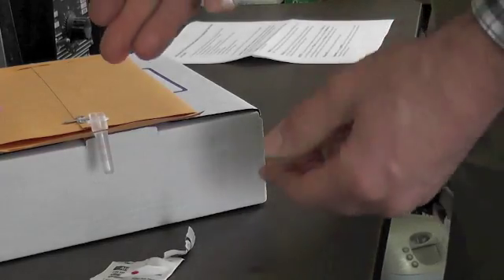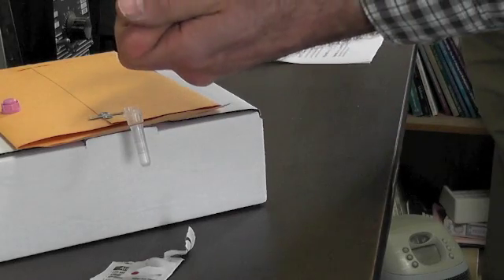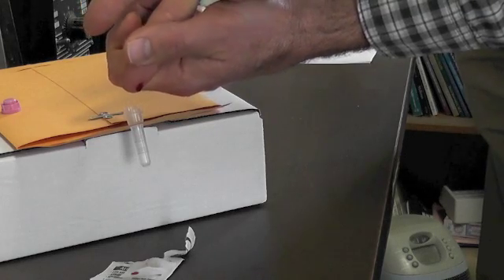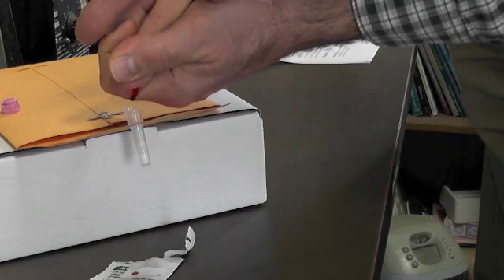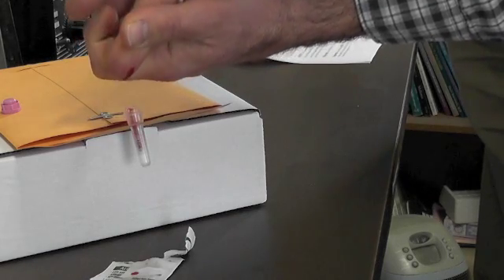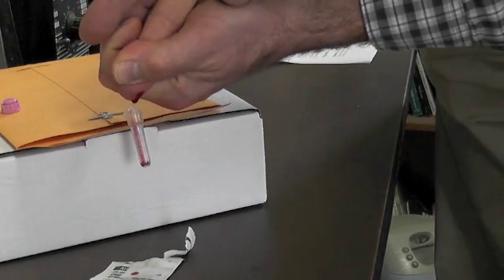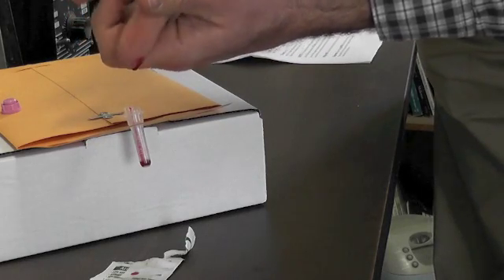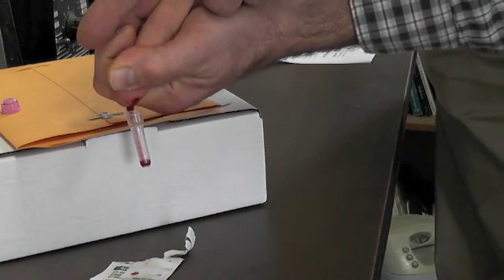You don't want to touch your finger onto the microcontainer. You want to get a hanging drop of blood there. Get that hanging drop of blood and the blood can touch there, like that, and let it run down. Pause in between, let the microcapillaries fill the blood again, and you can squeeze that out and get another drop there.